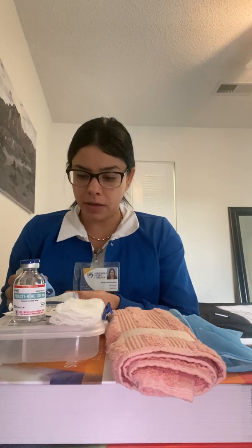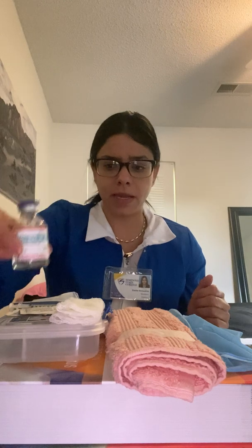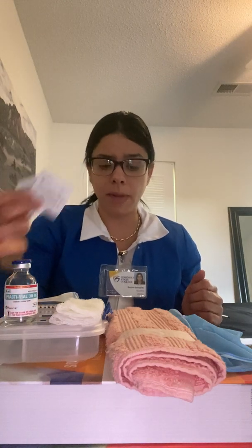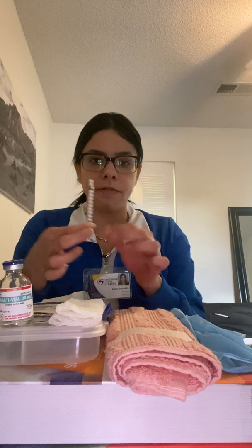After I'm done with that, I'm going to gather all of my instrumentation, which is already here, all of the things that I need. The vial, like I said, is where I'm going to draw my medication. I have alcohol pads, I have gauze, I have gloves, and I have my sharps container, which is this plastic box, where I'm going to dispose of my syringe and my needle after I'm done. This is going to be my arm.